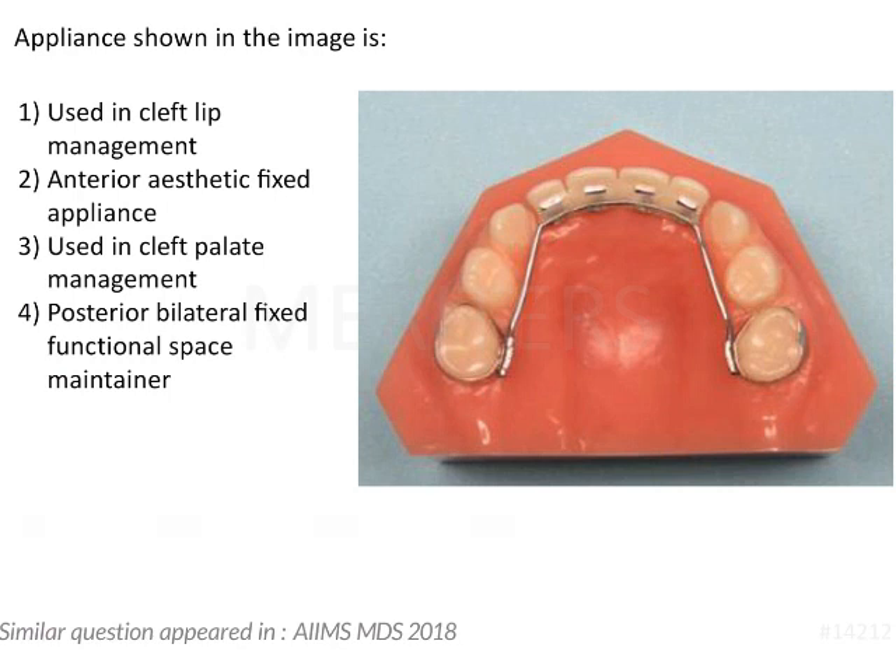To identify the appliance given in the image, starting from the posterior aspect, we can see that the molars are banded. There are bands present on the molars and a stainless steel wire which has been soldered onto the molar bands. Going anteriorly, we see that there are four artificial anterior crowns which are soldered onto the anterior aspect of this wire.